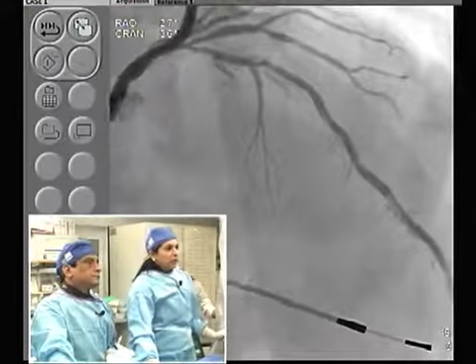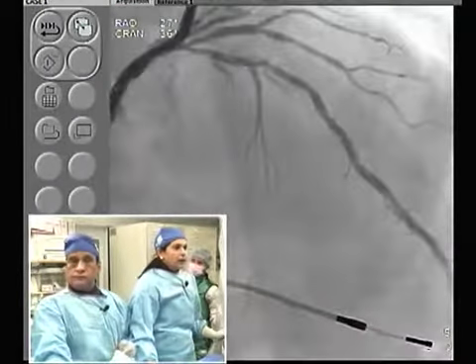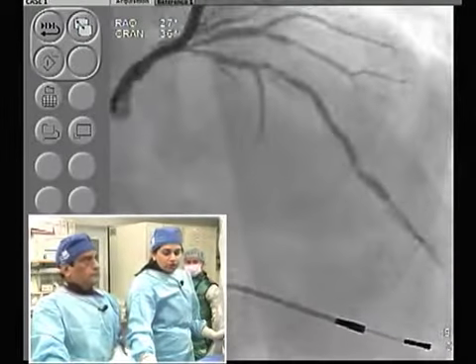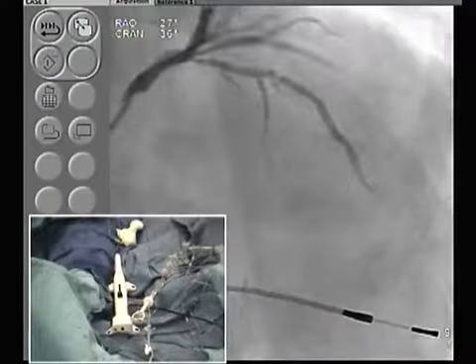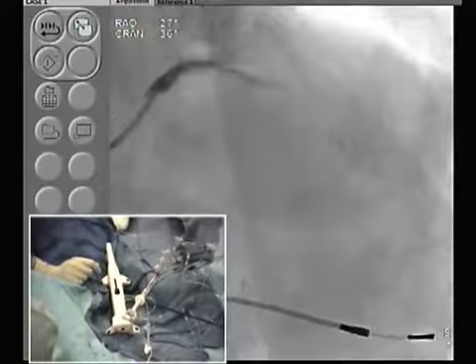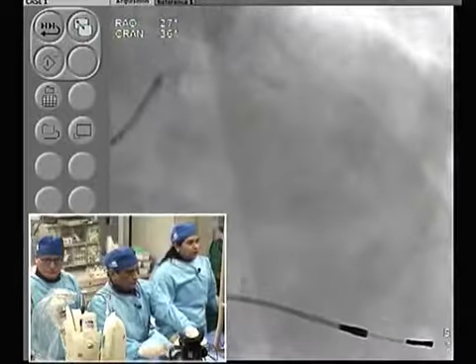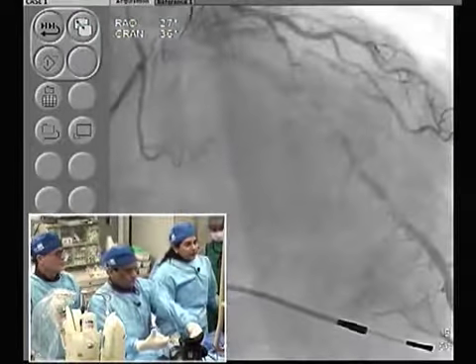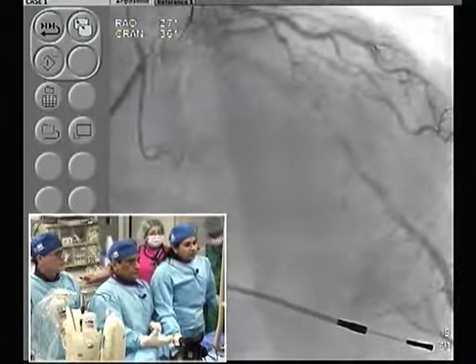We took a 1.75 burr, and you start right from the proximal, coming out of the left main, with the 3 steps that we have gone over: you loosen the knob, move forward and backward there, then at the Y connector, and the last step is to do the Dynaglide, and then you start with your rota. It's a 1.75 burr with 150 to 155 thousand RPM, and since it's moderate, I think with just one pass you will go all the way to where the tightest lesion is.